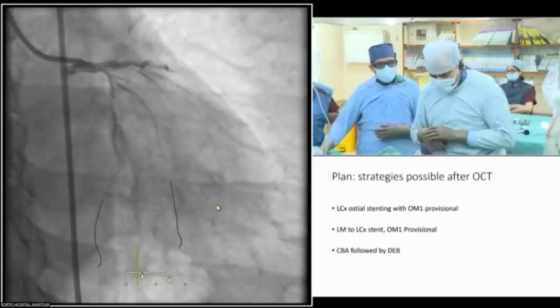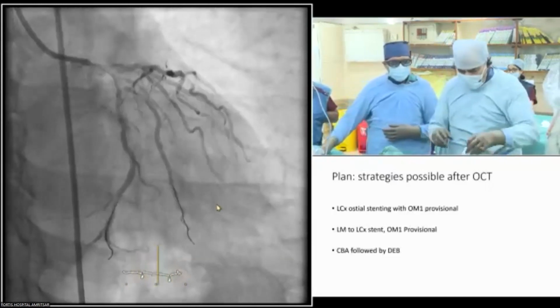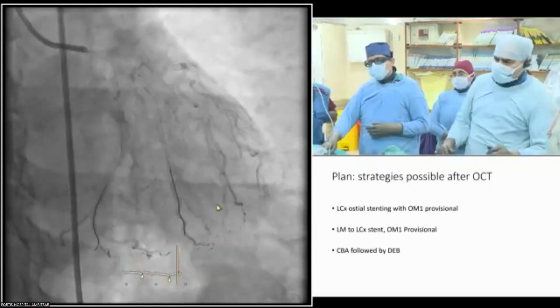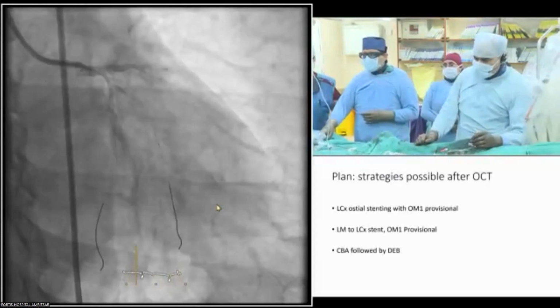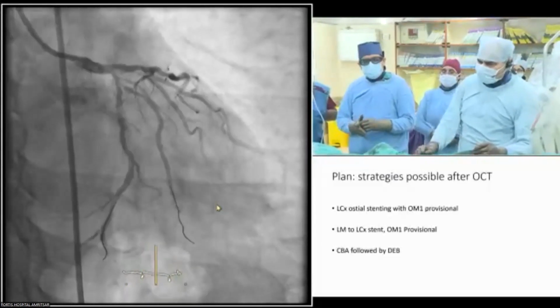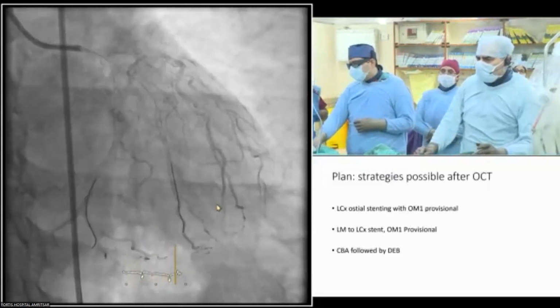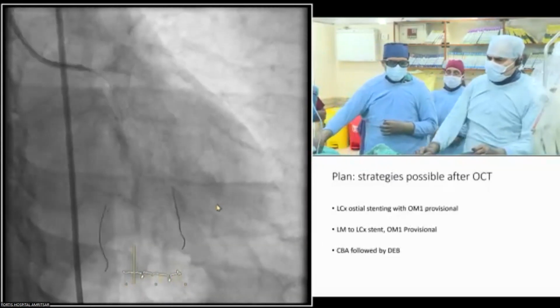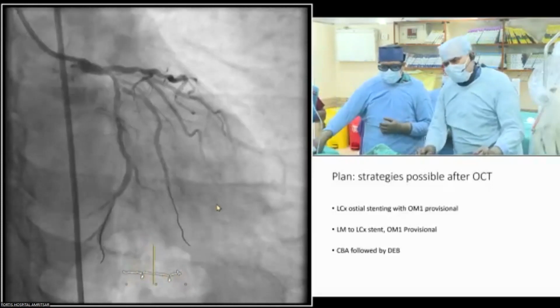She has a question. Yes, sir. I think once we have already balloon dilated, there's no point in doing FFR now. If we had to do it, we had to do it before balloon dilatation. Now, since it looks like a very small vessel, we have to undersize the circumflex. If the LAD was 2.4 distally, this definitely looks less than 2.5, not more than that. So if at all we want to do something, it would be a drug-eluting balloon rather than stenting or any other thing.